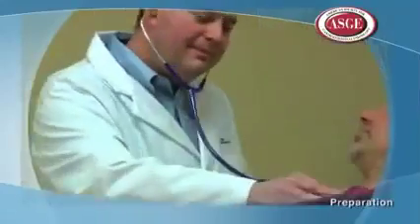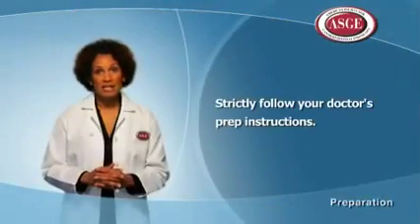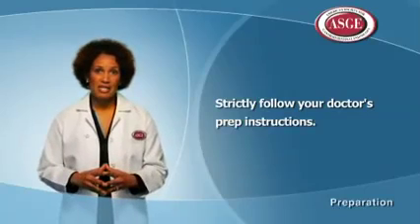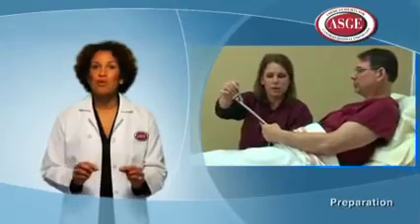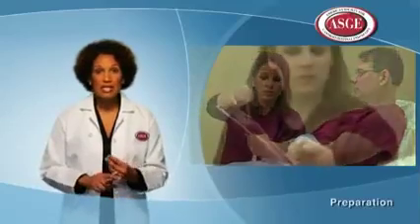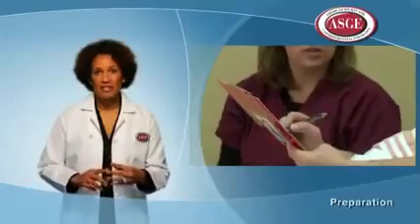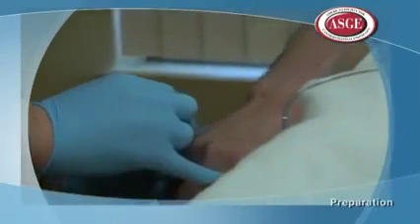Your doctor will also need to know what medications you're taking before your procedure. You may be asked to stop some of those medications before the exam. Before the procedure, the medical staff will provide you with an informed consent document to sign. This document goes over the risks, the benefits, and the alternatives of the procedure. Most colonoscopies are performed with the patient under sedation, which involves getting medication through the vein to make you sleepy.